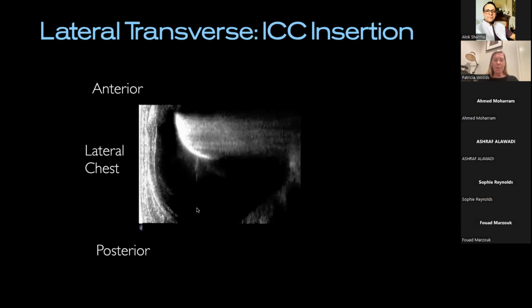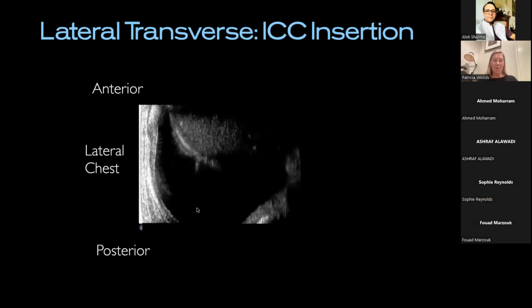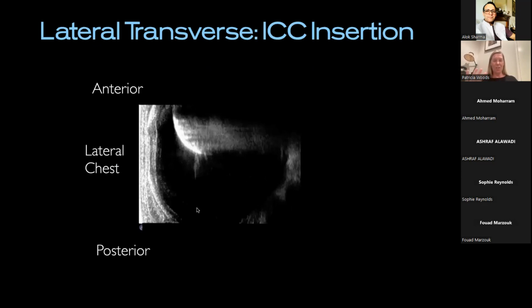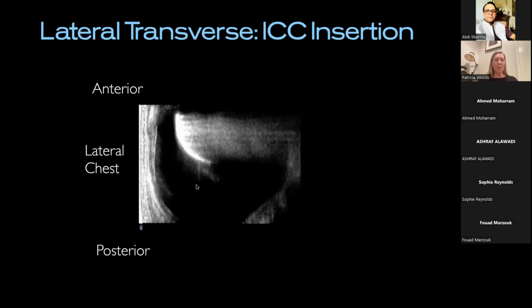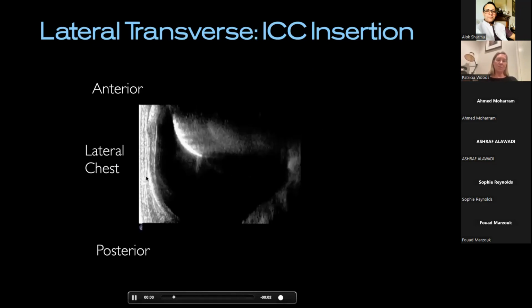Okay, so coming on here, I love my lateral costophrenic views. I'm showing you that. Just forgive me for the orientation. It's the best I could think of. Think of it like looking at a chest CT in a coronal plane. Basically, I've got a baby lying supine. I've put the probe across the baby's chest here, in a transverse plane, not a longitudinal plane. So I've got the front of the baby's chest, the back of the bed, and the lateral side.